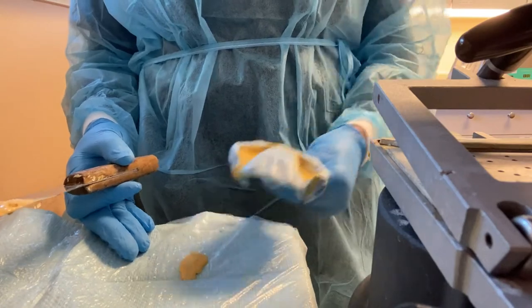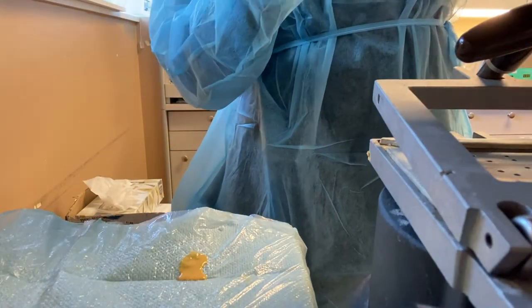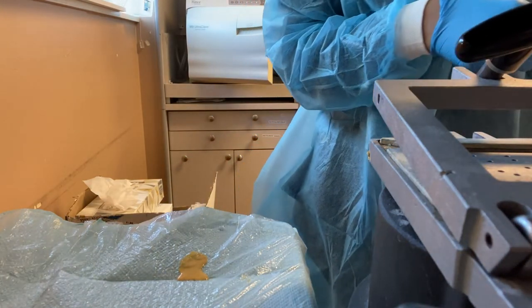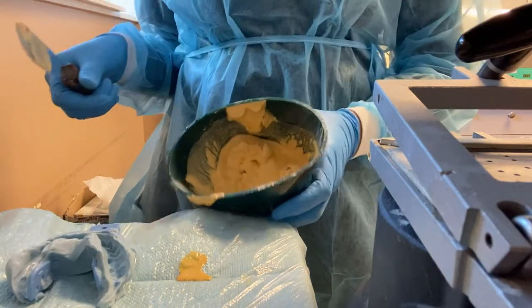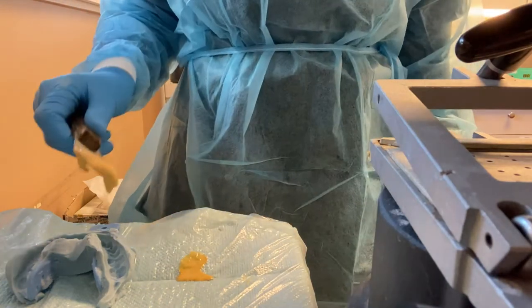So right now I'm just pouring impressions for all the assistants that have never poured impressions before or have poured impressions. You already know, it is so irritating. It can become very tedious. It can become very frustrating. It's all about pretty much just getting the right mixture of the base for the most part.